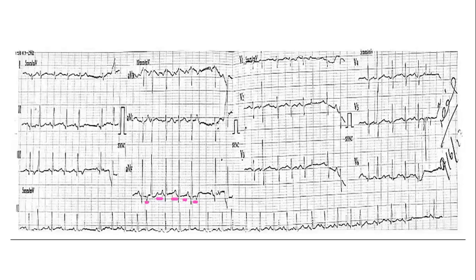Look at limb lead 2 because this is a good lead for the P waves. So do you think it's very grossly irregular? Look at the RR cycle length. Is it irregularly irregular or is it pretty regular with a bit of variation? What do you think? Do you think it's very irregular? No, it's not.